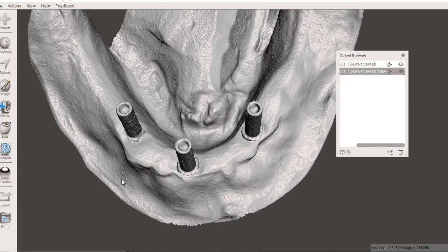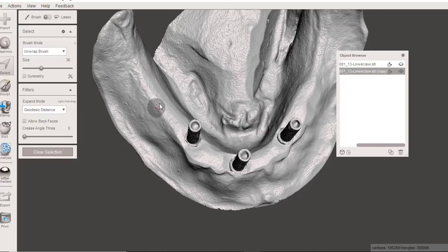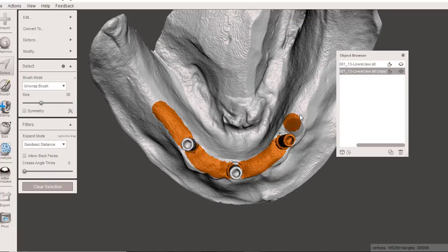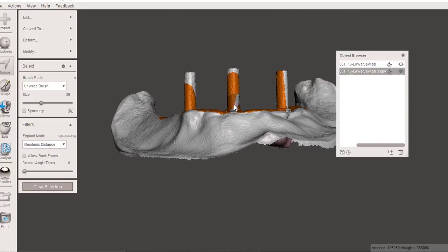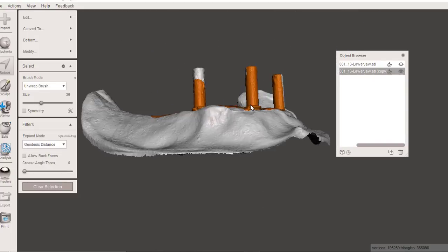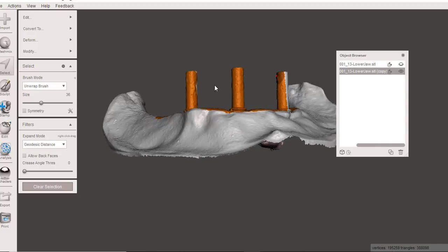So what I'm going to do first is take my select tool and select along the ridge the outline of what I want my bar to be. So I'm going to come straight across the ridge, and about right there is as far as I would want to extend any kind of a cantilever. I'm going to include all of these cylinders here, which is optional. We're going to end up cutting them out later, but for right now I'm just going to include them.